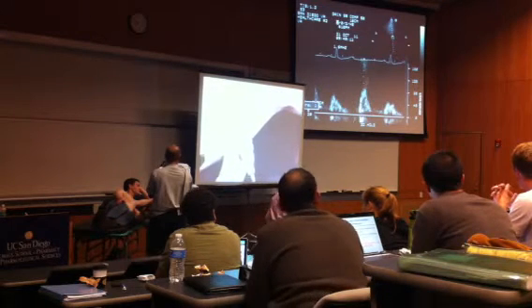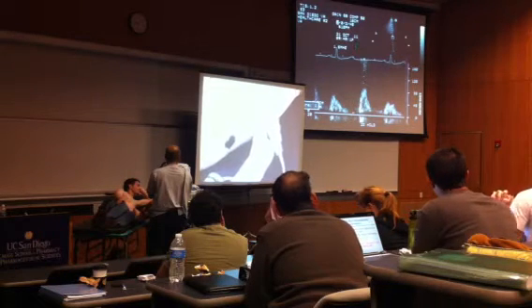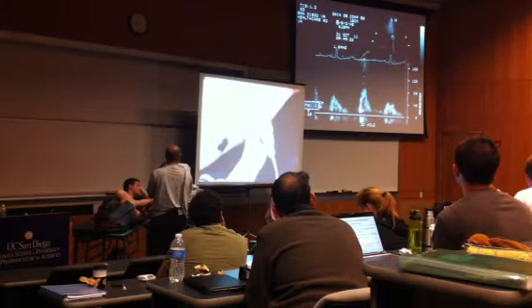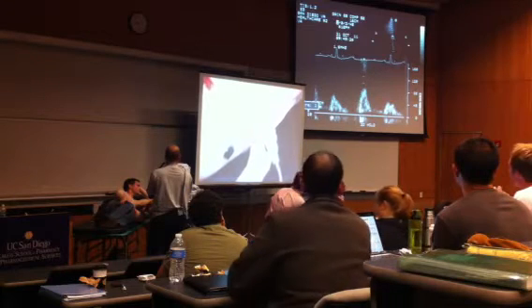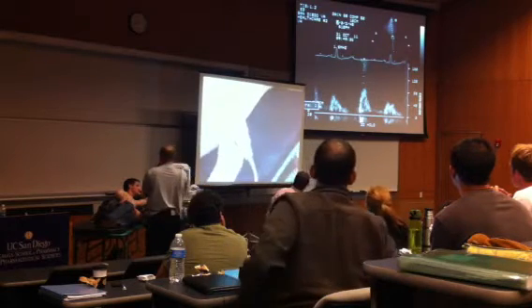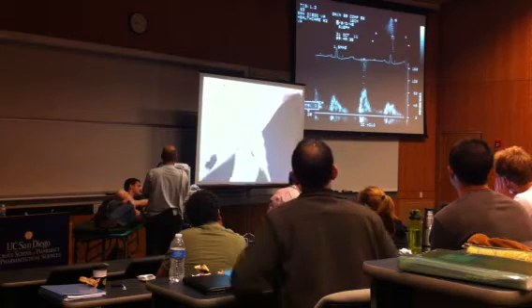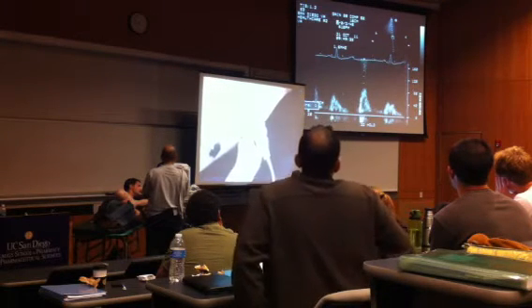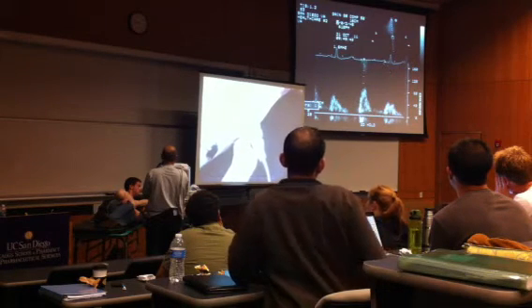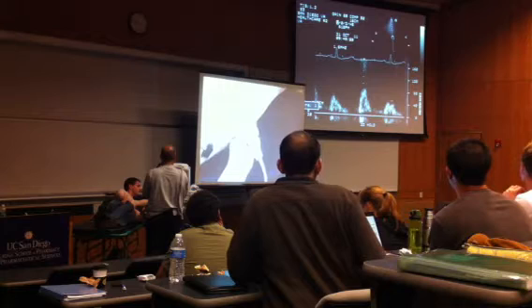What period of the cardiac cycle is here? Systole or diastole? Look at your EKG. So this is diastole. Okay. What's going to happen just after the mitral valve opens, which is difficult to see right on here? Blood's going to flow in, and we see this wave here, which in echo parlance is termed an E wave, or the early filling. As that valve opens, blood flows in. Then there's a period of diastasis. We have our P wave. What's going on here? Atrial kick and an A wave.